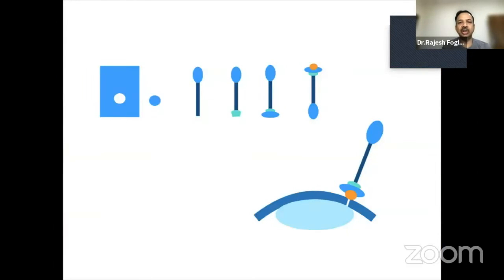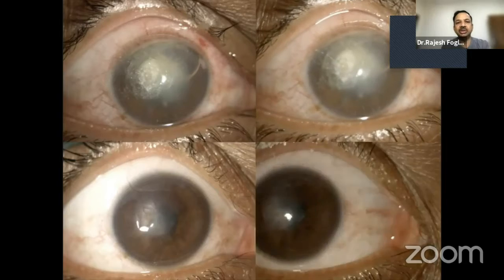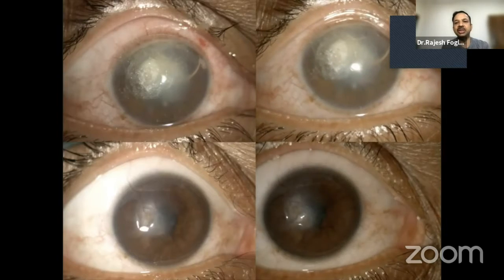So you take a cotton swab, cut it, and apply some ointment at the tip. Then you can pick up the disc of plastic that you have created with the punch, apply a little bit of glue, and then bring it to the point of application.